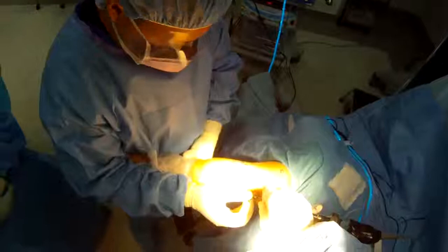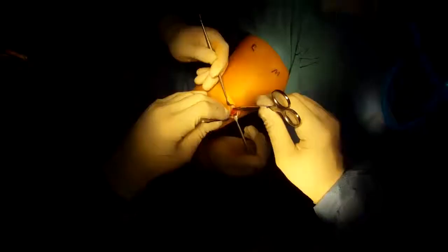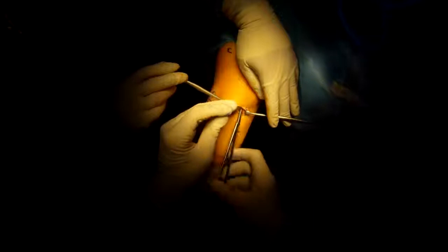Here we place a skid. We use a cannula - this is for the endoscopic cubital tunnel release. This is what it looks like from the outside. We use a special scalpel blade to cut through the tissue above the nerve that's scarred to it and compressing it. Now I check with a scissor to make sure there's plenty of room for the nerve.